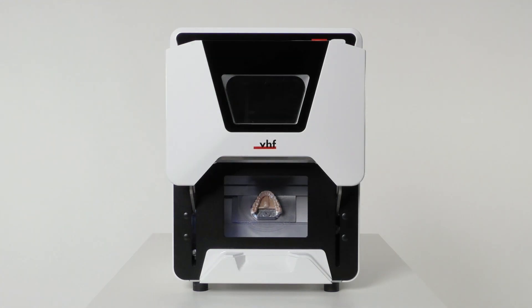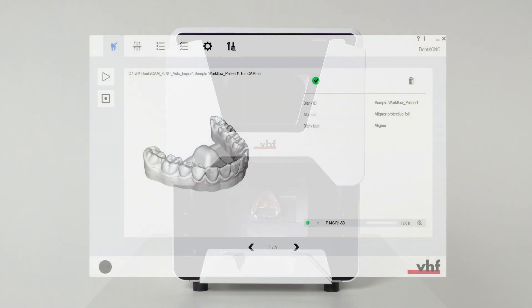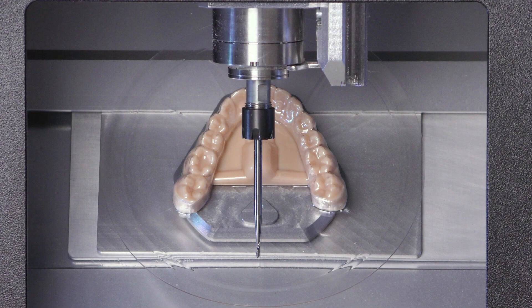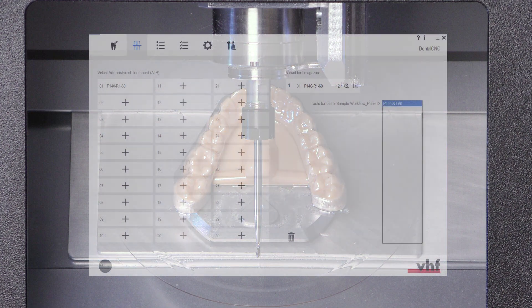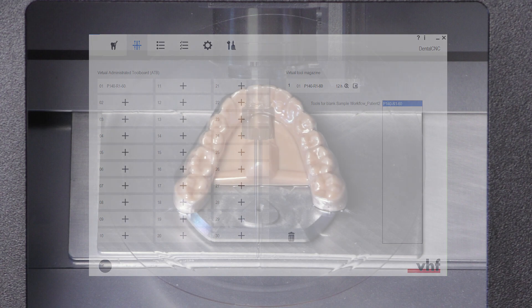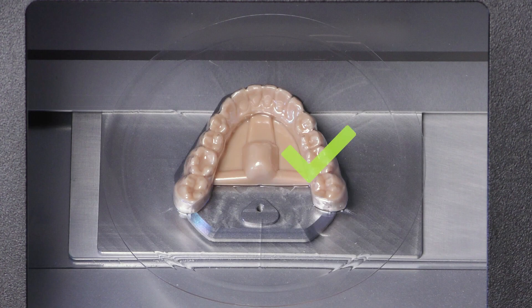Before executing the job, ensure the following. Firstly, you created a job in trim cam and it has been transferred to dental CNC. Secondly, the required tool is in the collet chuck and is neither worn nor damaged. It was also added to the virtual tool magazine in dental CNC. Thirdly, the required blank is mounted.